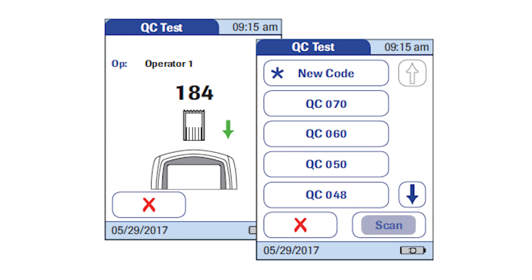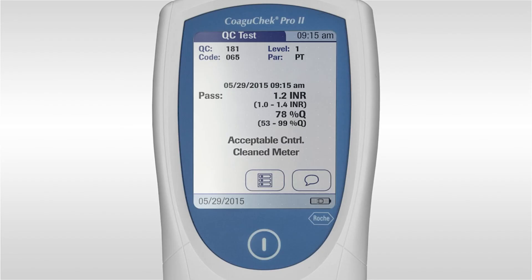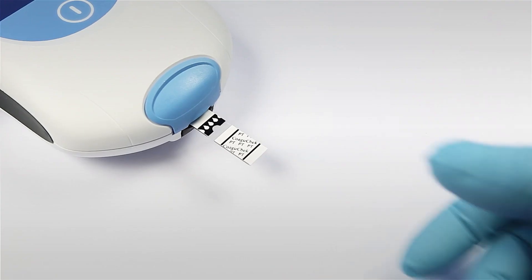Alternatively, you can press scan and scan the barcode. If the meter has already seen the quality control lot number, you can press scan and scan the barcode on the quality control ampule. If the meter fails quality control, it is recommended to repeat the test. If the meter still fails, troubleshoot by using new strips and quality control solution. Please dispose of the used quality control ampule, pipette and test strip as per your local guidelines.